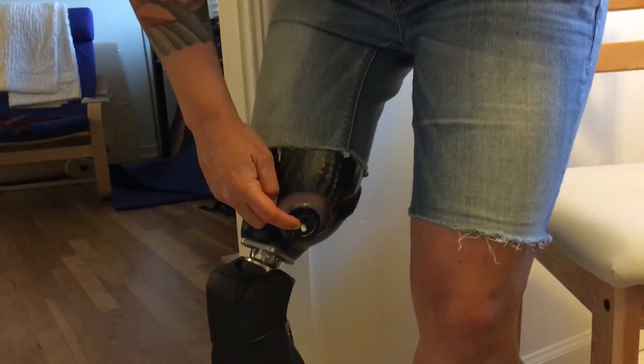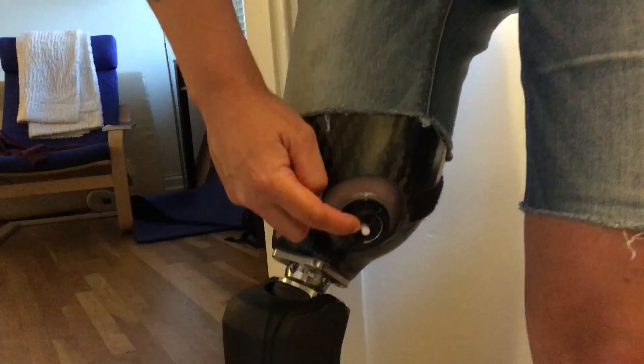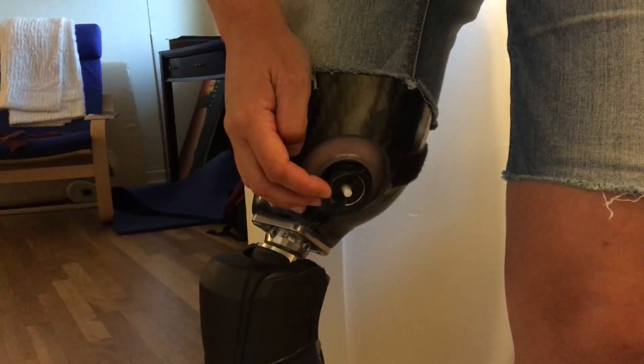Also, there's a release button right here. If anything pushes that, then it's going to release the suction and the leg's going to come off.